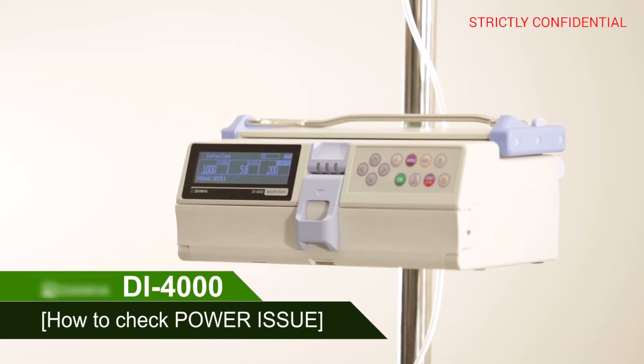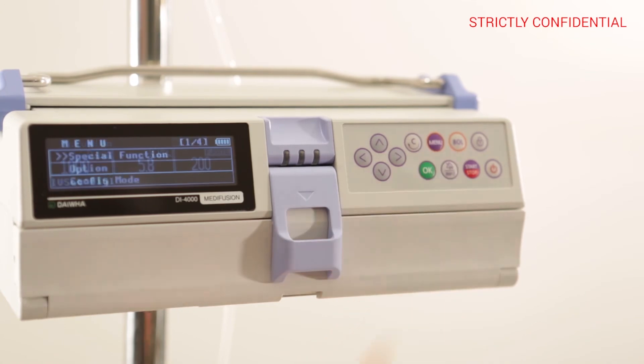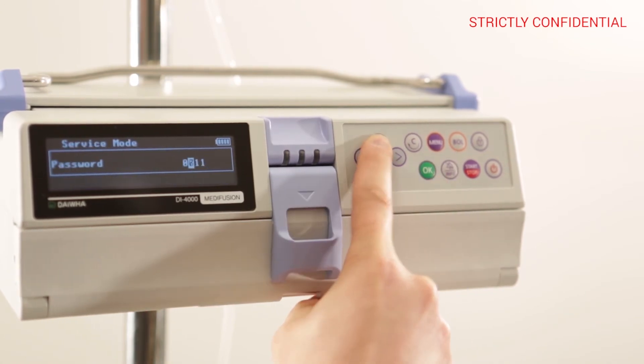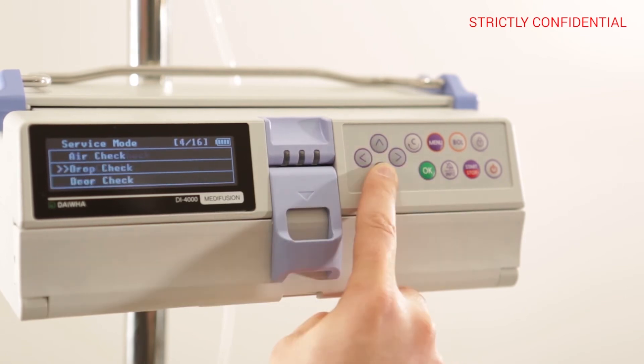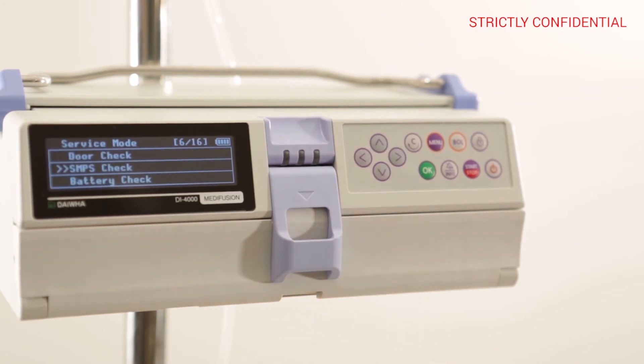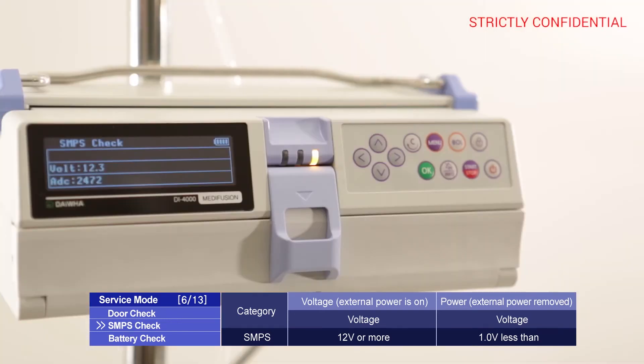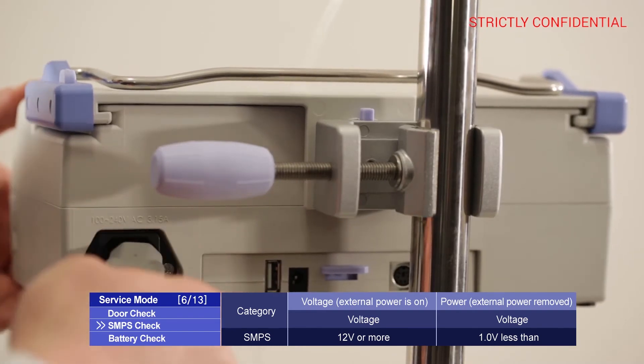How to check a power issue: press the menu button and enter service mode, entering 1711 as the password, and use the arrow keys to enter the SMPS check. If the power supply is connected, the voltage value is 12 volts; if not connected, the voltage value is 1.0 volt or below.